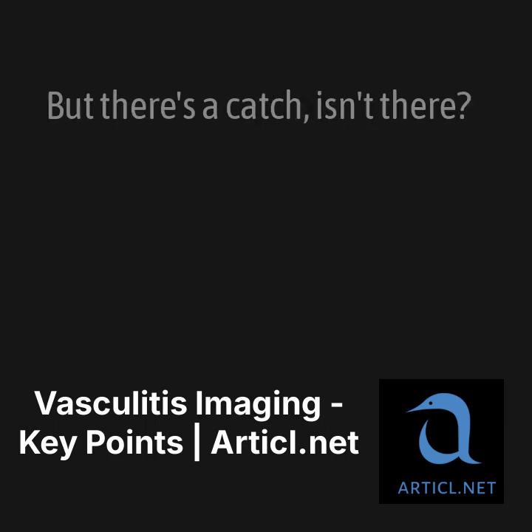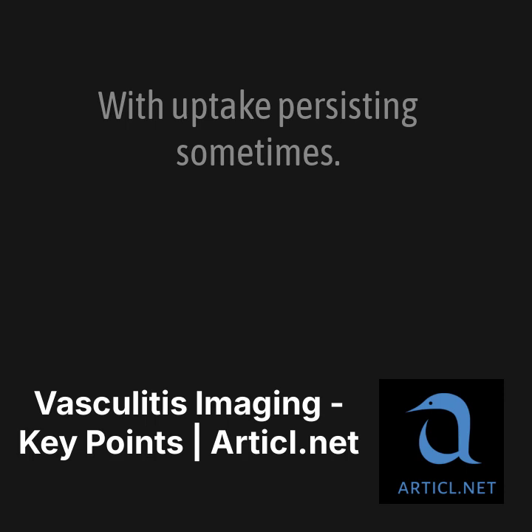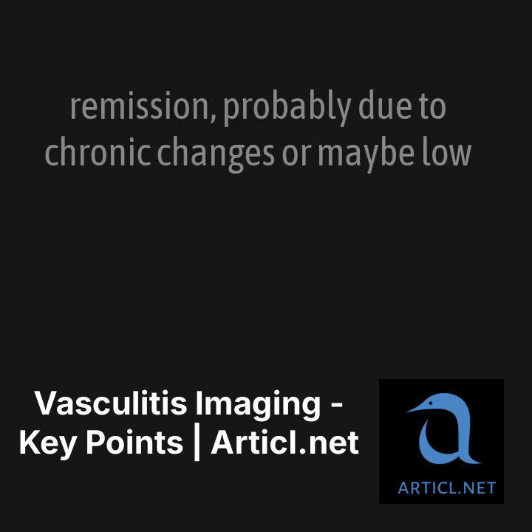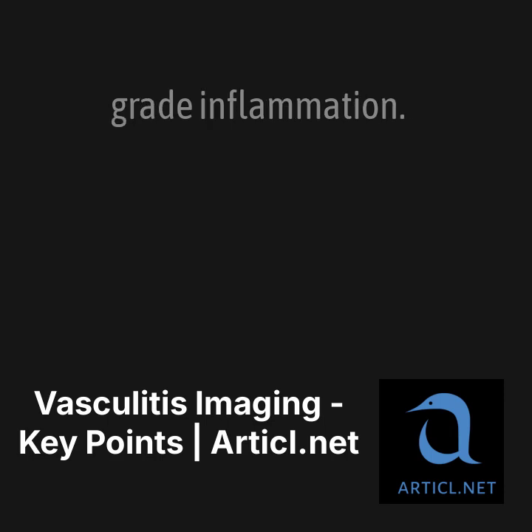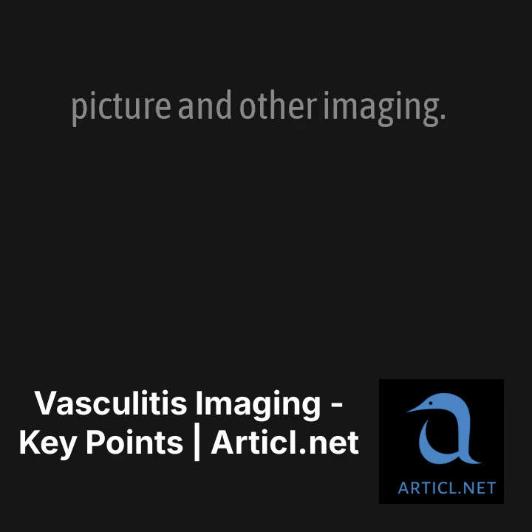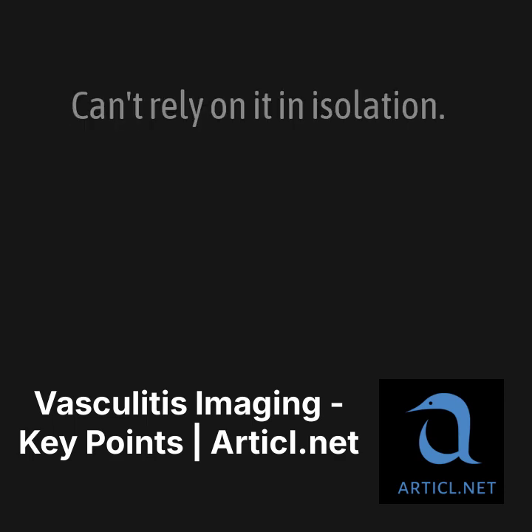But there's a catch, isn't there, with uptake persisting sometimes? Exactly. That's the crucial point. FDG uptake can hang around even when the patient's in remission, probably due to chronic changes or maybe low-grade inflammation. So you absolutely must correlate PET findings with the clinical picture and other imaging. Can't rely on it in isolation.